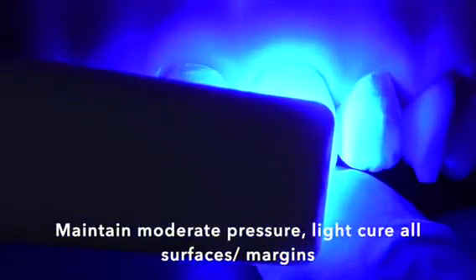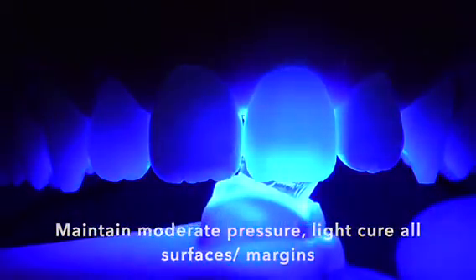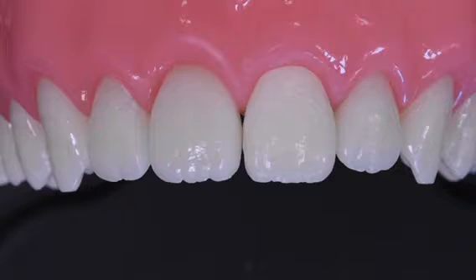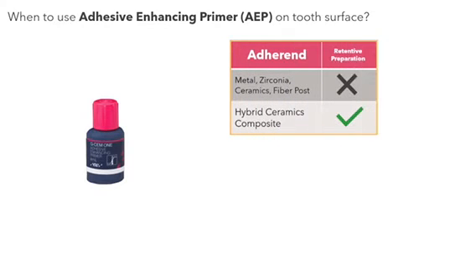Continue to maintain moderate pressure and do full cure on all surfaces and margins. This table shows you when to use the adhesive enhancing primer on tooth surface for different clinical situations.